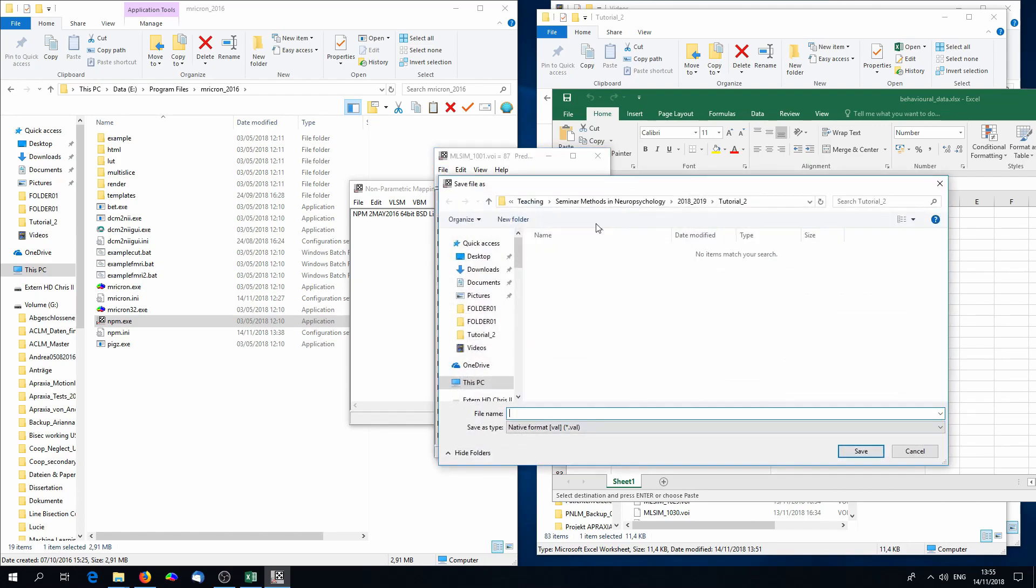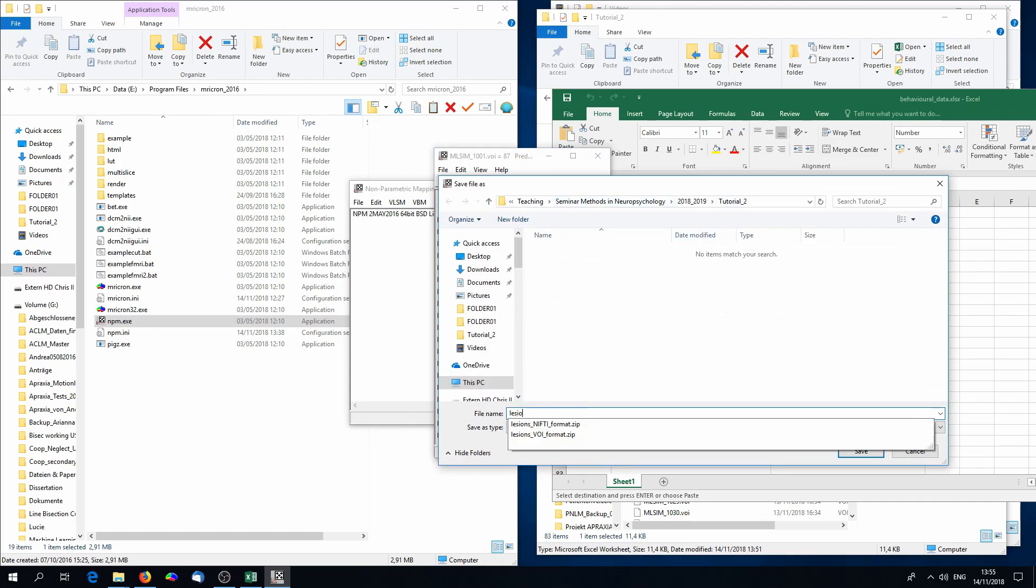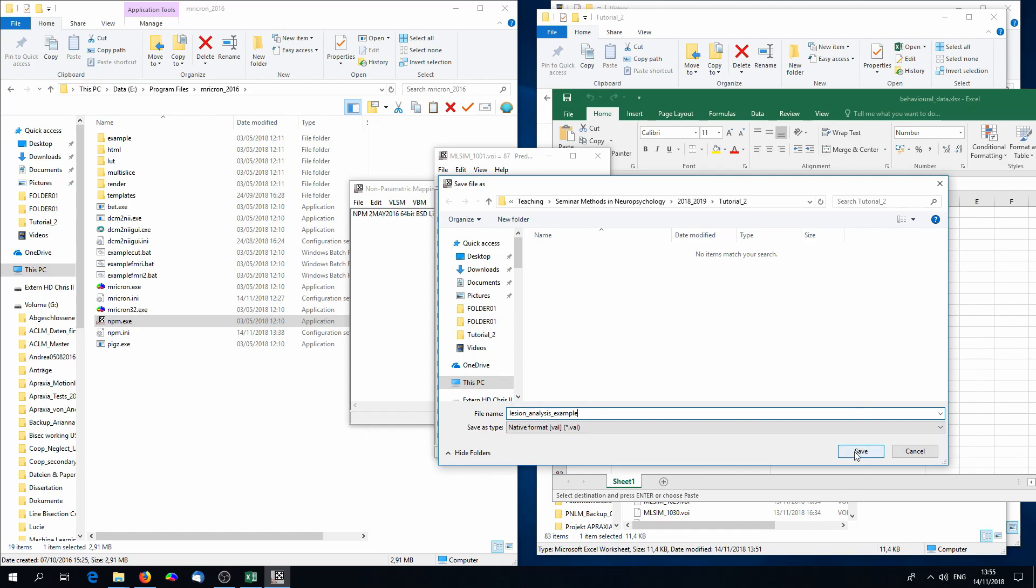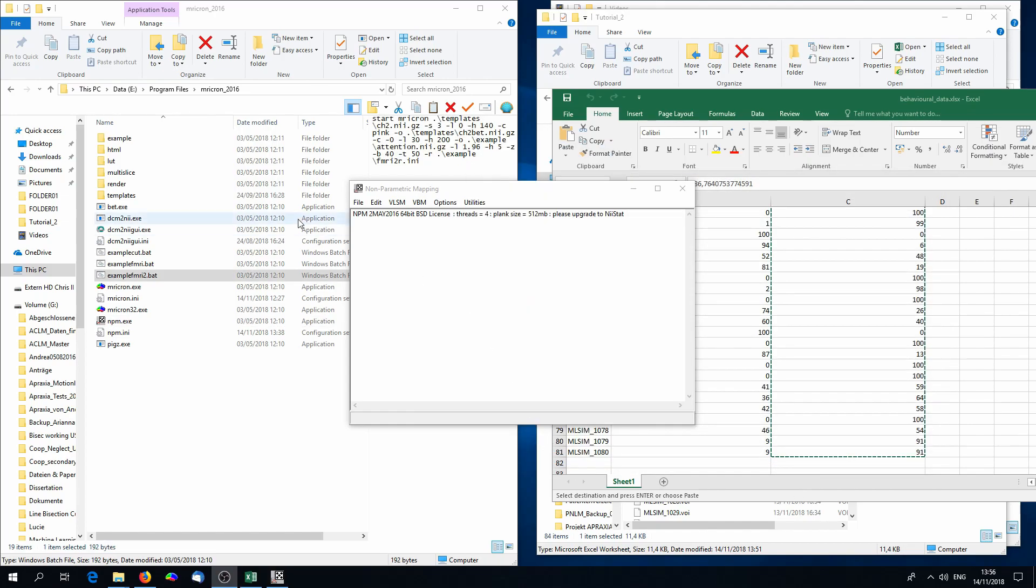That's all we need. Go to File, Save, and save this design file. The outcome is a .val file. That is a specific kind of file for NPM.